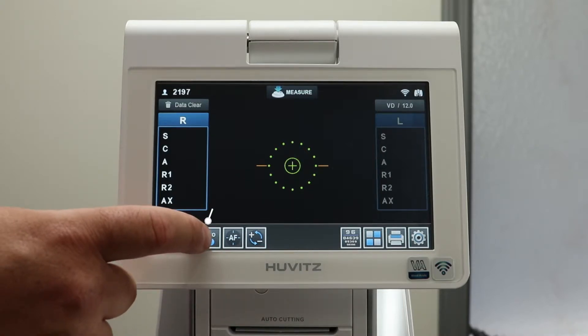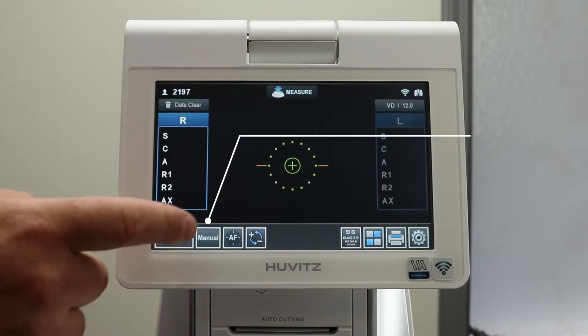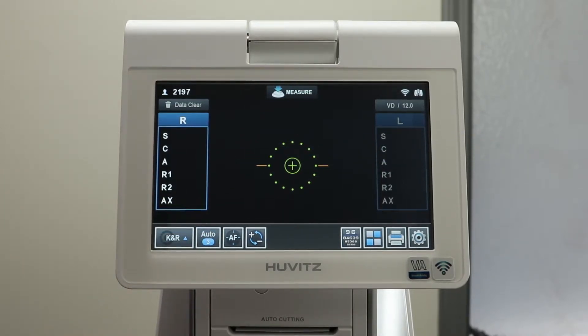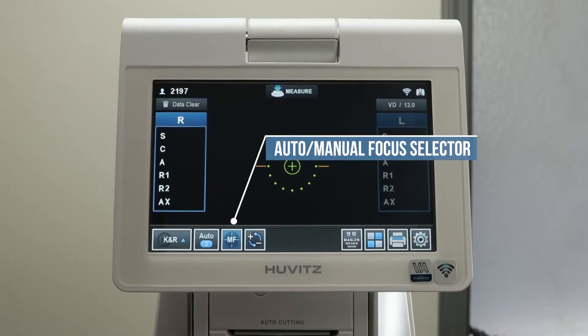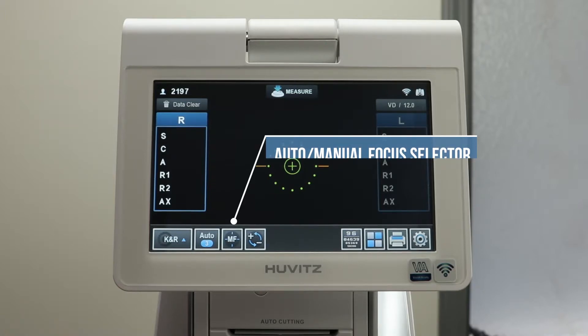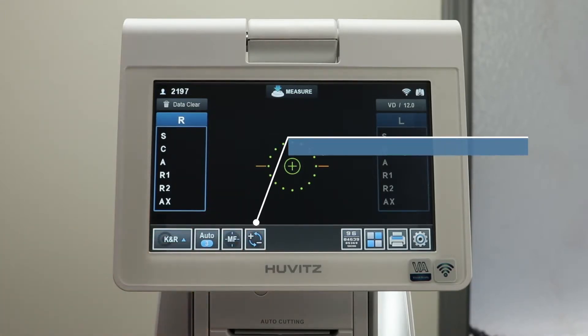Next is the auto-measurement and manual measurement selector. Continuing right is the autofocus and manual focus selector. And finally, the plus and minus cylinder selector.